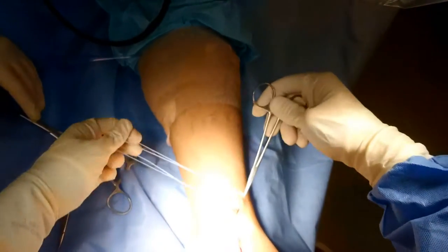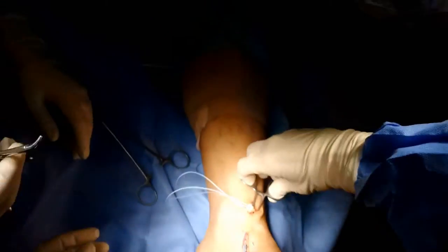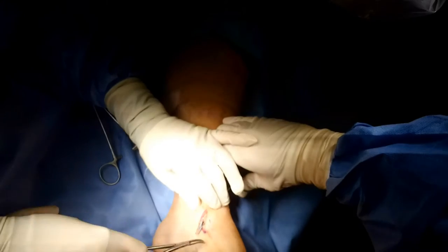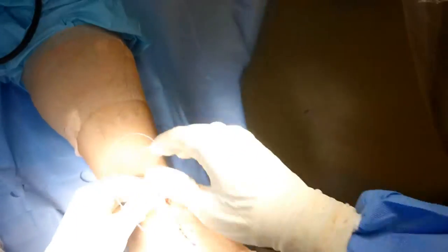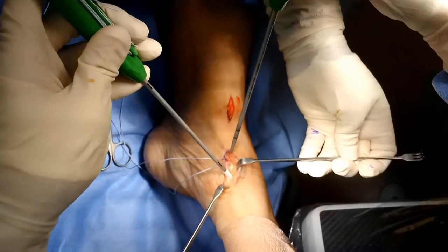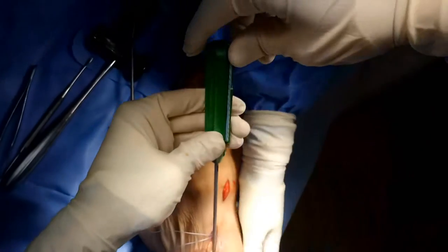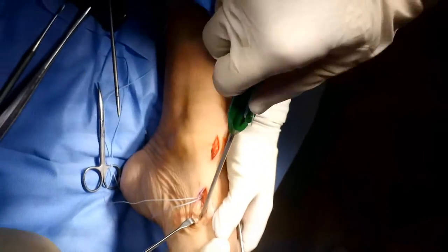Here you see the tendon being passed through that incision site. Make sure to keep it within its sheath — that way it minimizes adhesions of the tendon and allows for better gliding. Once it's passed, you will need to anchor it distally at the dorsal cuneiform. Here you're seeing the anchor go in. It's verified under fluoroscopy, and it also has a number two FiberWire attached to it.